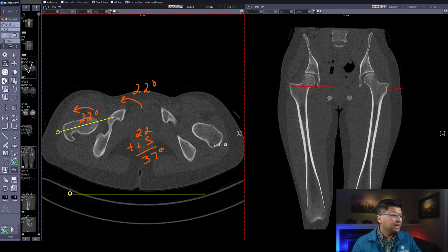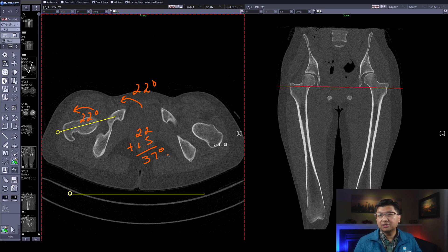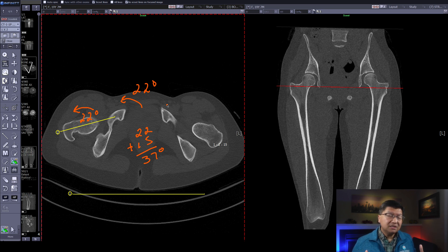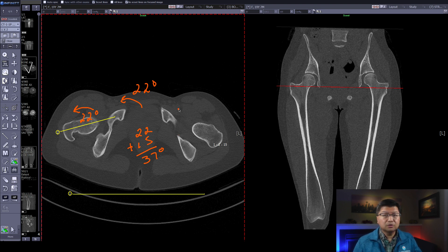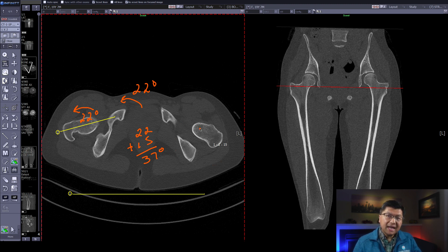So we have right-sided anteversion of 37 degrees. The normal anteversion is between 30 and 40 degrees at birth, but it becomes about 15 degrees as you reach adulthood. So this 37 degrees for a 19-year-old is definitely abnormal. Similarly, you're probably going to get something similar on the left-hand side, so there is severe anteversion of the femur.